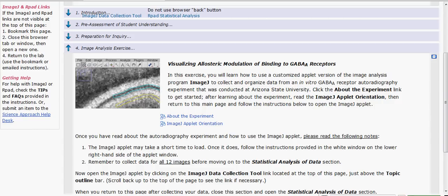This is a demonstration of how to collect data from the autoradiography images provided as part of the NeuroVisions lab seeing GABA-A receptors at work.